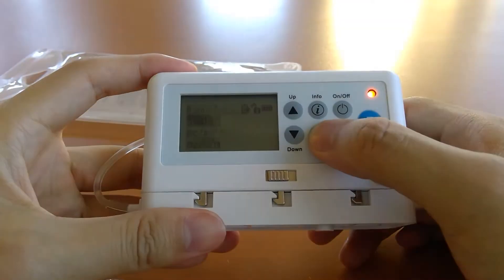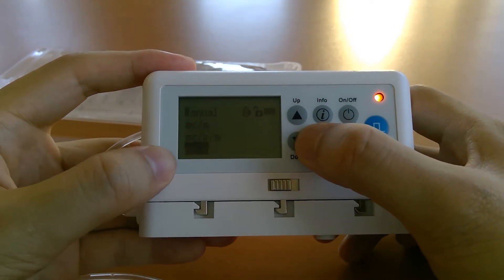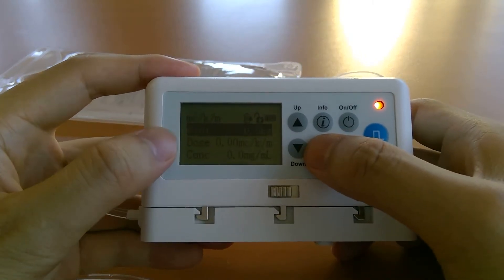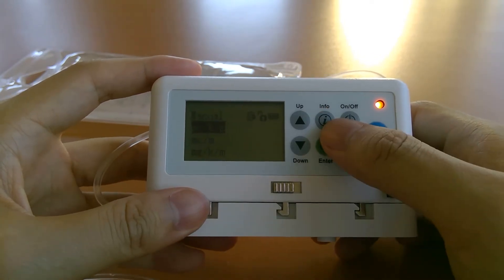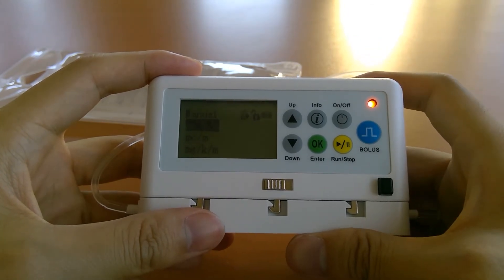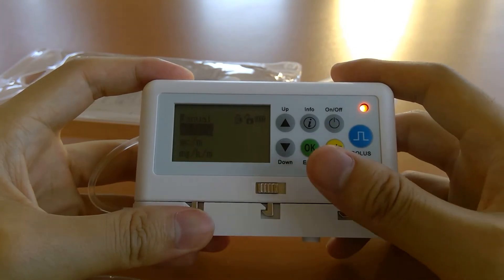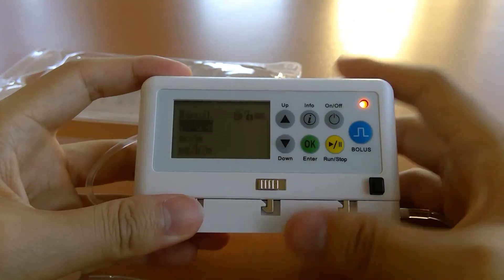We also have a manual mode with options for mcg/kg/min, mcg/min, mg/kg/min, mg/min, and continuous volume over time. With any of these, the parameters are blank and you simply enter them in — the pump calculates a rate and runs. The max rate on this pump is 135 cc's per hour. If you enter a combination of parameters that calculates above that rate, the pump will display an invalid rate error and won't run the infusion, requiring you to go back and change the parameters.